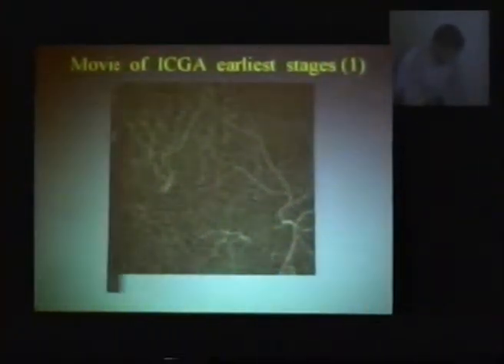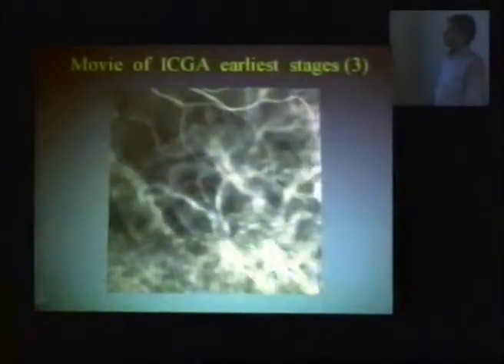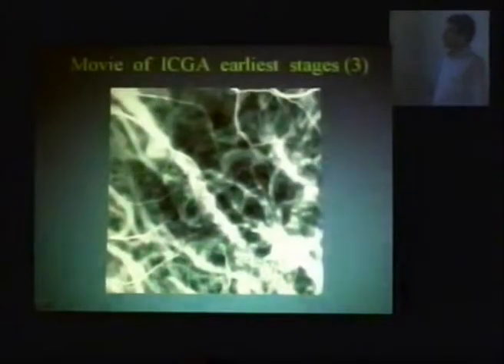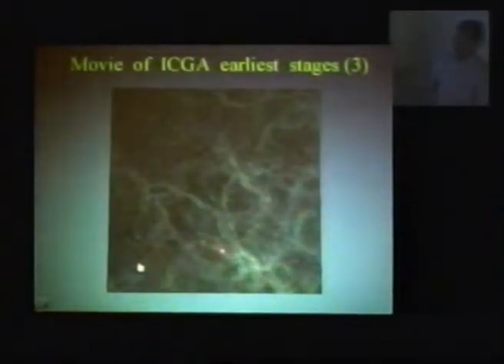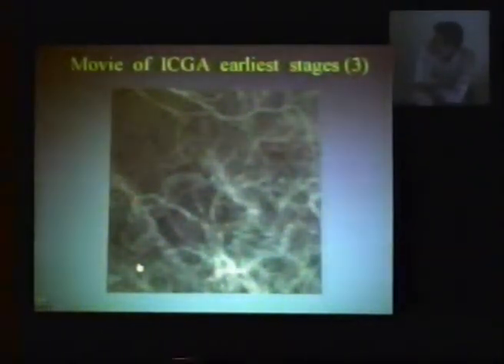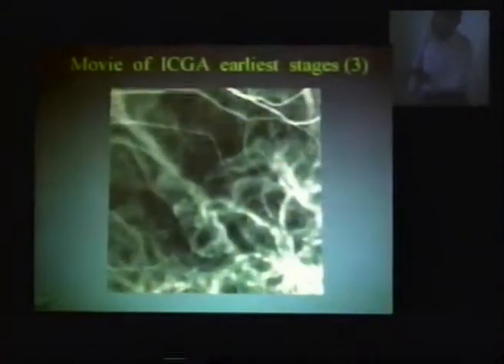Second example. Okay, we look at it and then we look at it again. It's very fast, you know. We don't know what's happening, so we look once. Okay? It's very confusing. We don't know what's going on. We do it again. We freeze, okay? And we see the first vessels is one here and one there. Then we go again. And we look, say, okay, that's going over there. See that? Going over there. See this? C and B. Okay, now you can see very clearly.